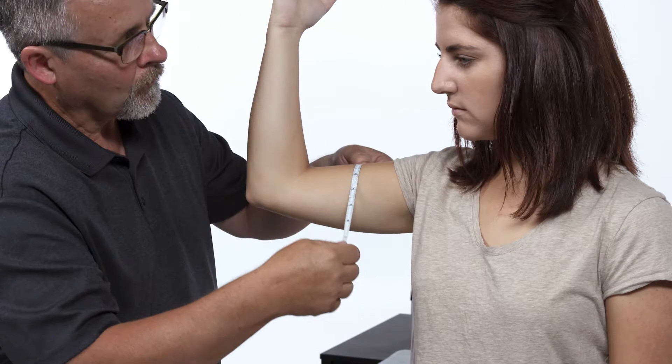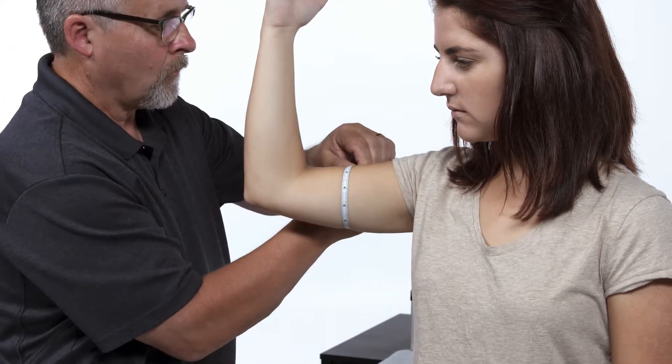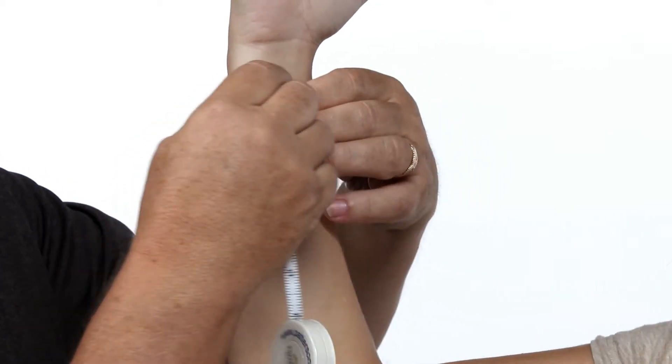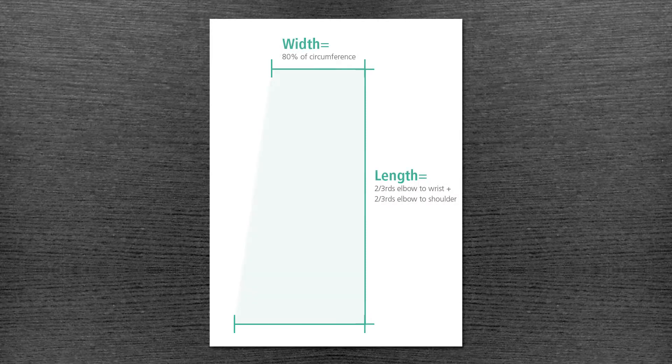The width of the splint material is measured by 80% of the circumference of the mid arm and 80% of the circumference of the distal border. The pattern typically has a trapezoid shape.